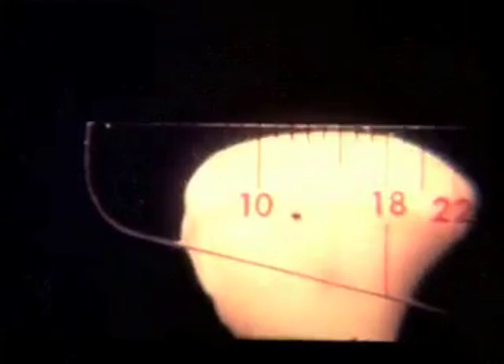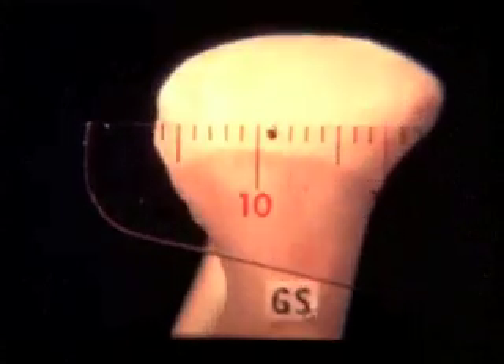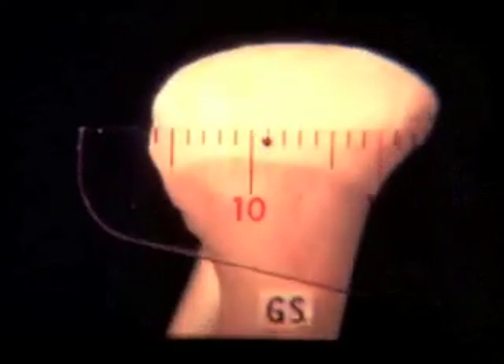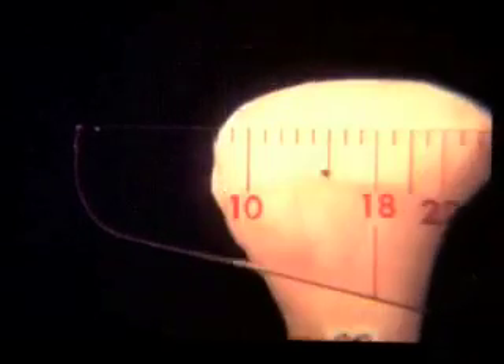A mandible mounted in the replicator using the subject's previously measured coordinates provided an excellent frontal view of lateral condylar displacement during chewing, as measured by a millimeter ruler. It has been termed the immediate side shift component of Bennett movement.